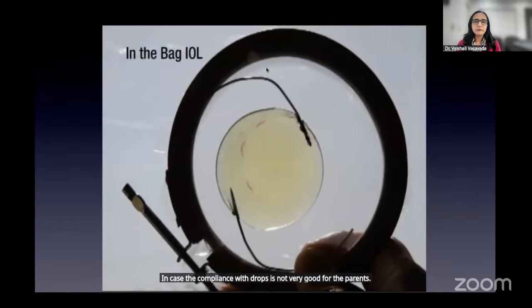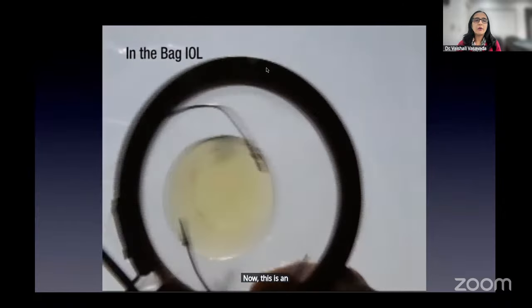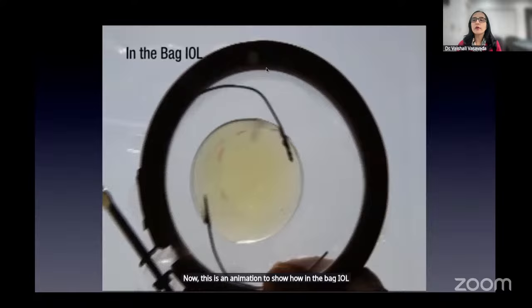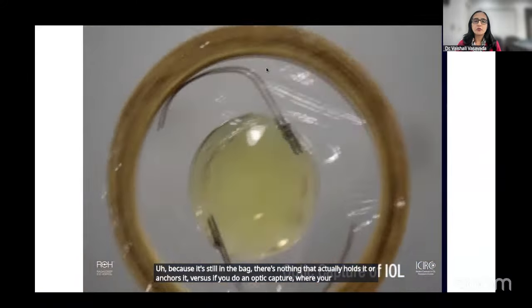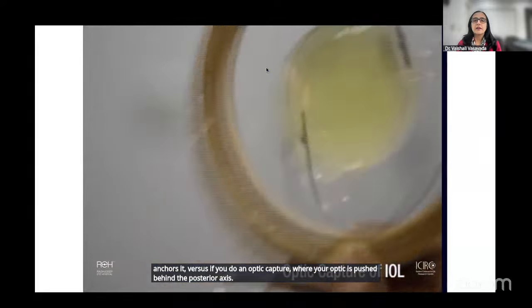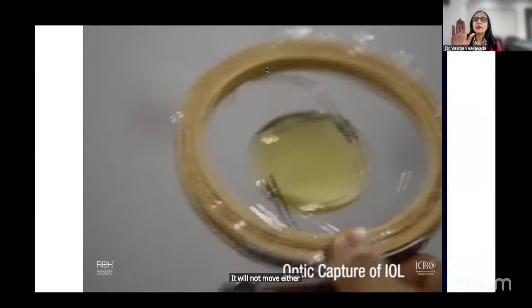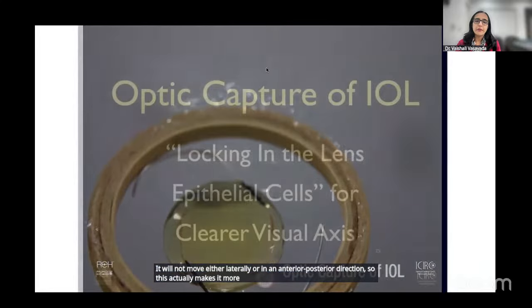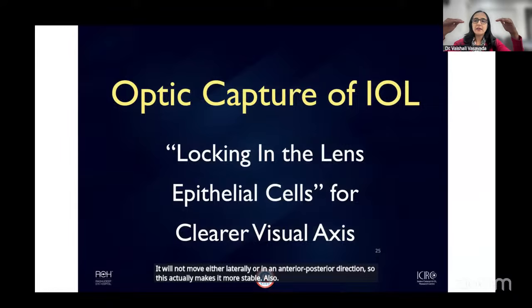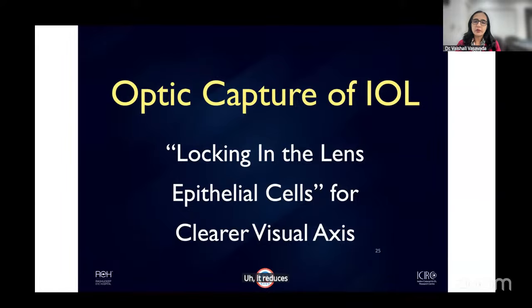Now, this is an animation to show how an in the bag IOL can move because it's still in the bag. There's nothing that actually holds it or anchors it, versus if you do an optic capture where your optic is pushed behind the posterior capsulorhexis, it will not move either laterally or in an anterior posterior direction. So this actually makes it more stable. Also, it creates a barrier through which the lens epithelial cells cannot penetrate. So it reduces or delays the visual axis obscuration.